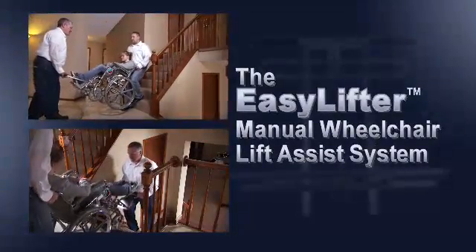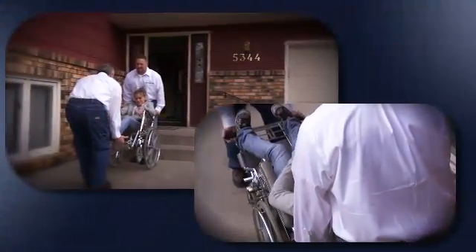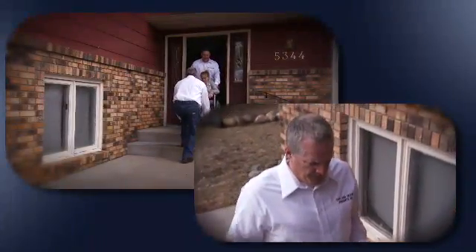The EasyLifter manual wheelchair lift assist system is a valuable design improvement to standard wheelchairs. The EasyLifter kit enables standard manual wheelchair passengers to be confidently moved from level to level with the assistance of two capable lifters.